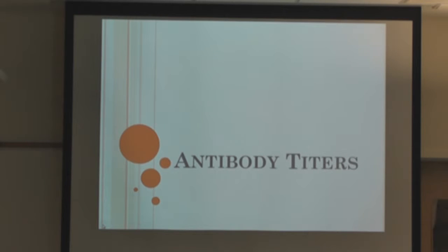So if we had a situation where we had a child that we needed to give platelets to, and we were limited in our capability of being able to give something that was plasma compatible, we might titer the isohemagglutinins to give them the lowest titer of anti-A or anti-B, whatever was going to affect them, that we could. Another thing that we could do is you could pack it, which would be spinning it down and taking more of the plasma off of them, or you could even wash it, which would be to resuspend them back in saline. But knowing the titer is going to be able to tell you what your step is going to be.